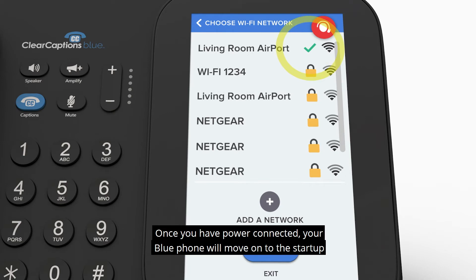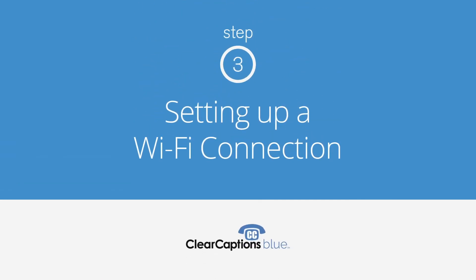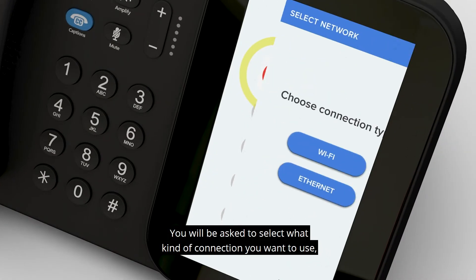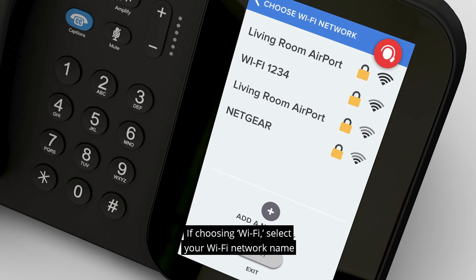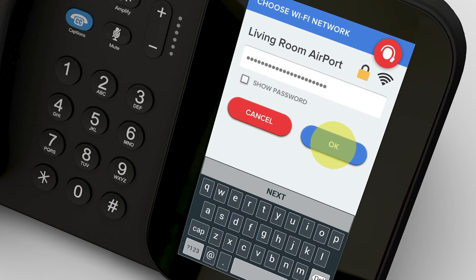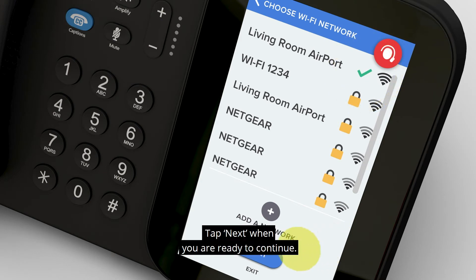Once you have power connected, your Blue Phone will move on to the Startup screen and then run the Setup Wizard. If you are not connected to the internet, you will see a red exclamation point for the first step on the Setup Wizard. You will be asked to select what kind of connection you want to use — Wi-Fi or Ethernet. Tap the Wi-Fi or Ethernet button on the Select Connection Type screen. If choosing Wi-Fi, select your Wi-Fi network name from the list and enter your password when asked.